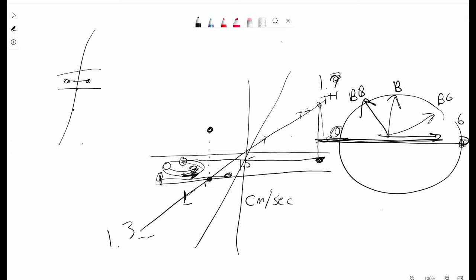Oh, yeah, for sure. There's only a handful of techniques that we can use to actually quantify. Most of what we're doing is visualization for the radiologist. Well, with AI, we'll be able to. You're right. Now, the phase contrast technique has about a 6% error rate, just because of the technique, right?